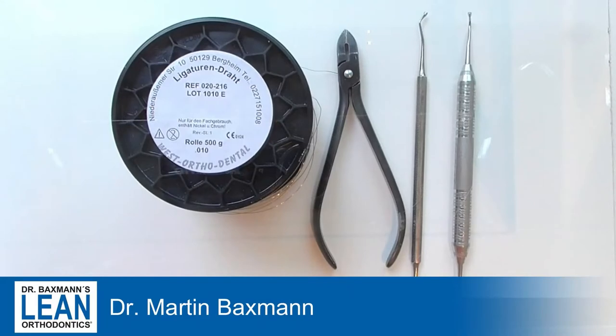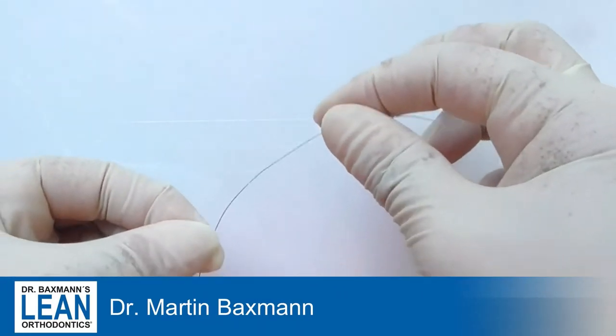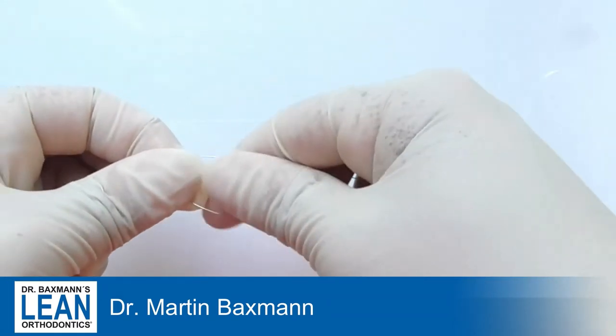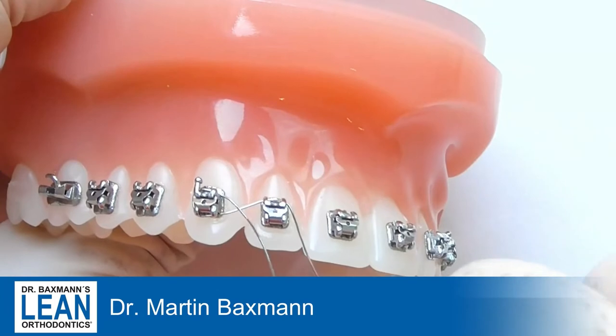Here you can see all that you need today: ligature wire, a cutter, a tucker — these are the main things that you need.